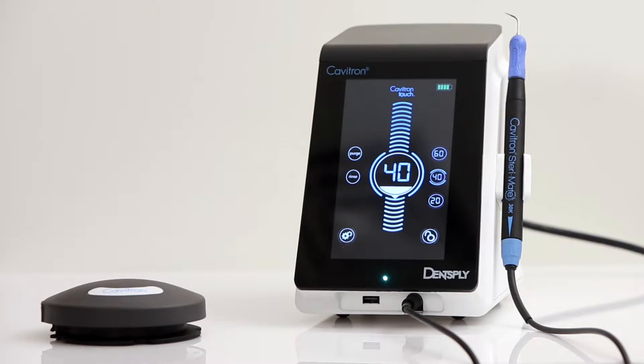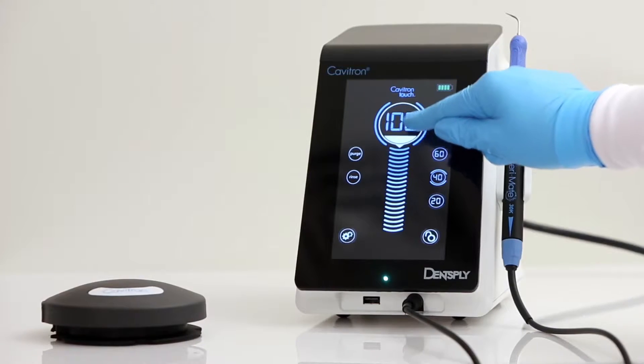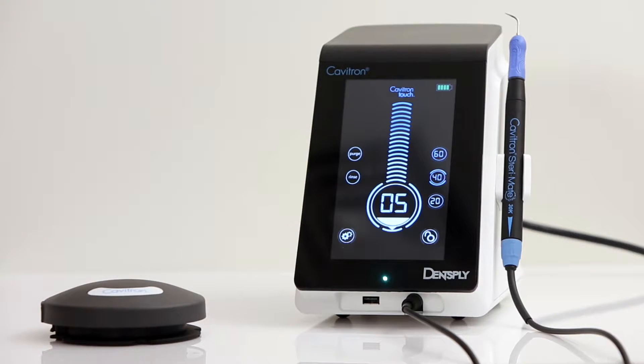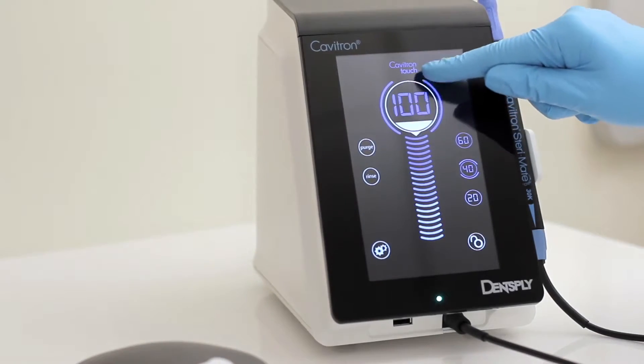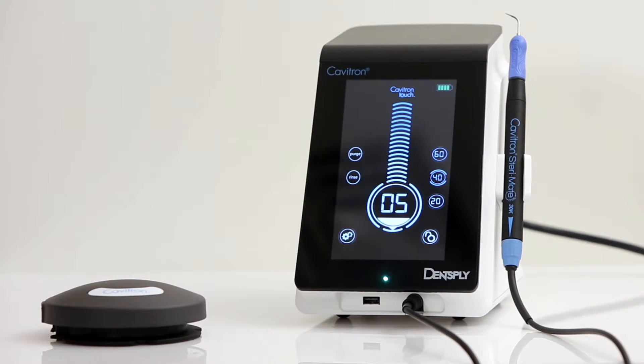To control the ultrasonic power level, simply slide to select your desired power level. Sliding up increases the distance the insert tip moves, while sliding down decreases the distance. A power level may also be selected by pressing the desired position on the power scale. The power range indicator fluctuates from 5% to 100%. Please note that there is not a visible blue zone; 5% to 35% is considered the blue zone range.